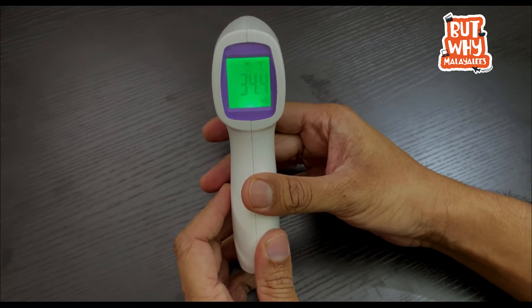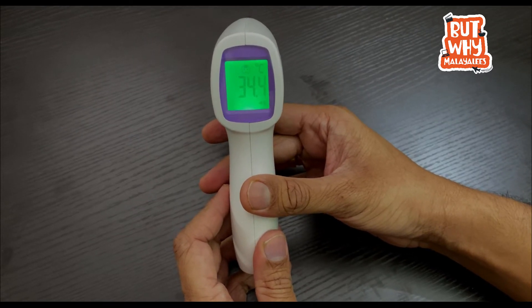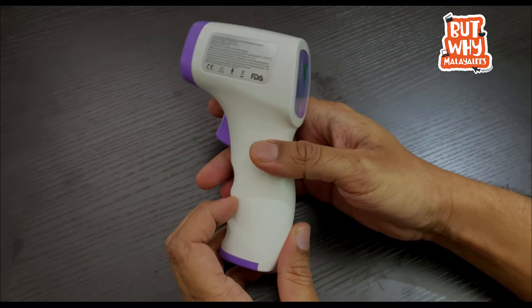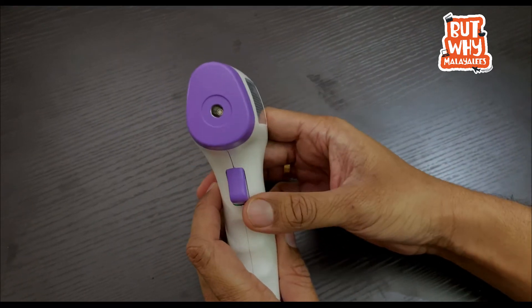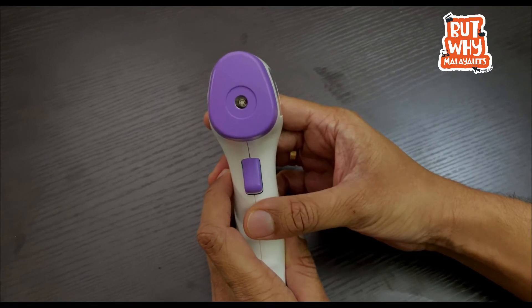The low temperature is green, the medium temperature is yellow, and the high temperature is red. I am going to scan the same temperature. This is the IR point — this is the infrared light. We are going to calculate the temperature.